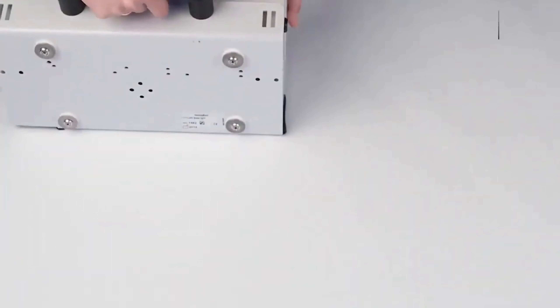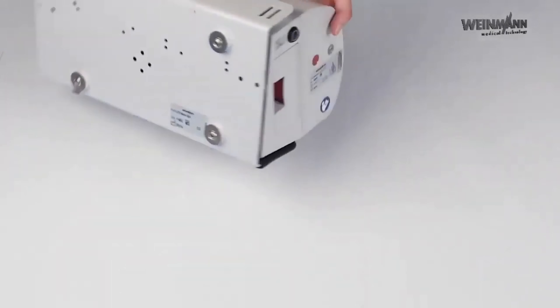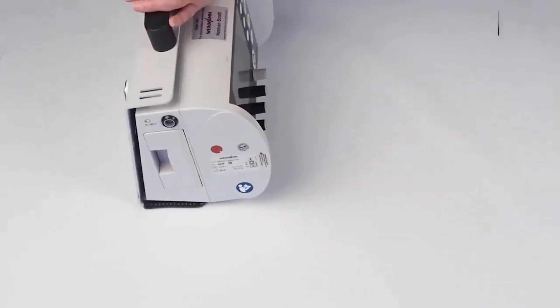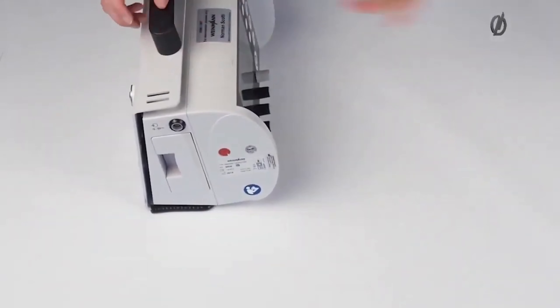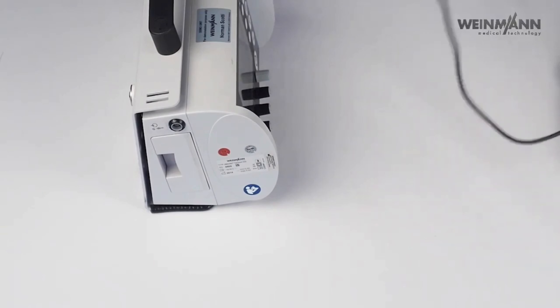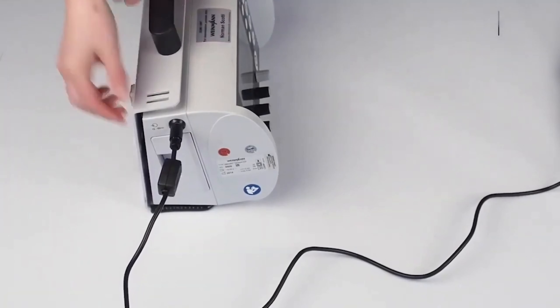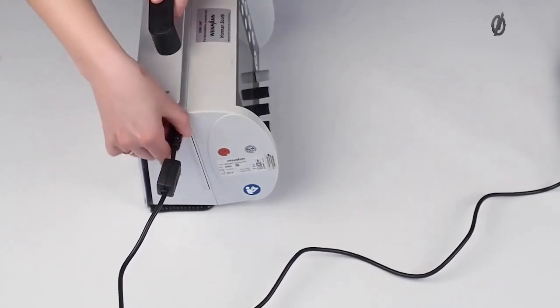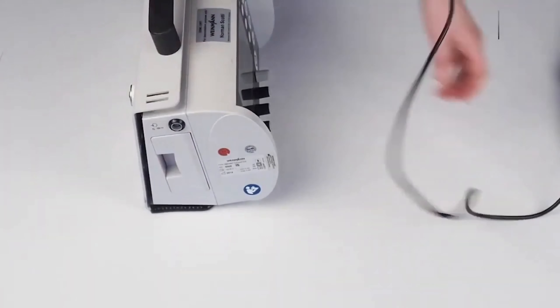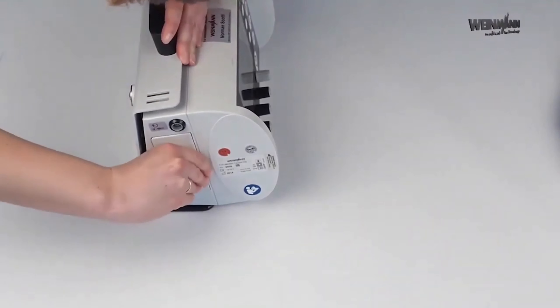This is the back of the device — nothing special here. These are screws to mount the device on the wall, for example. On the right-hand side we have our rechargeable battery and our power connection. If you want to connect the device to a 220-volt power connection, just plug in here and then the battery is automatically charged. Obviously, if you have the device in an ambulance, the power connection is automatically done via the wall mounting.